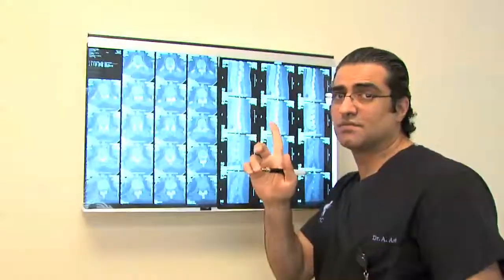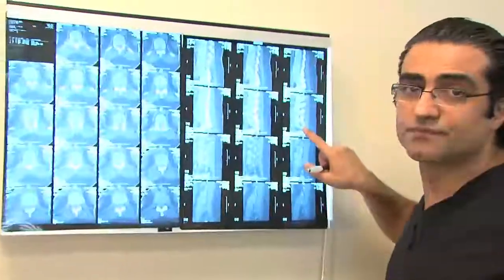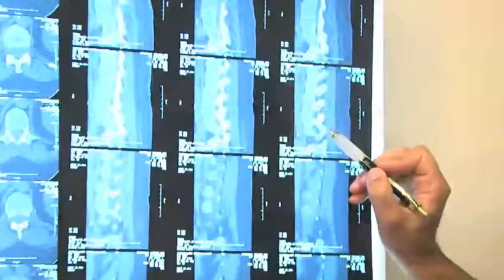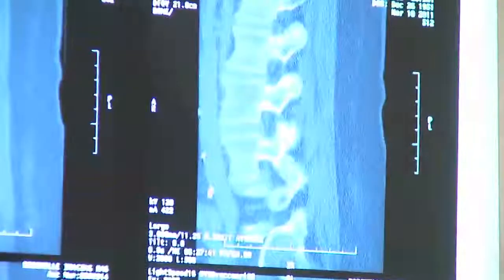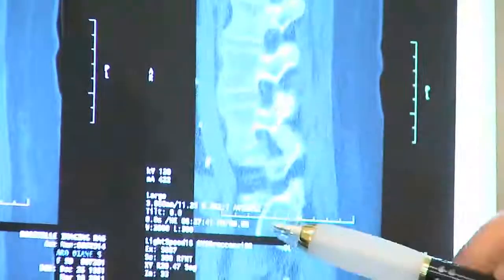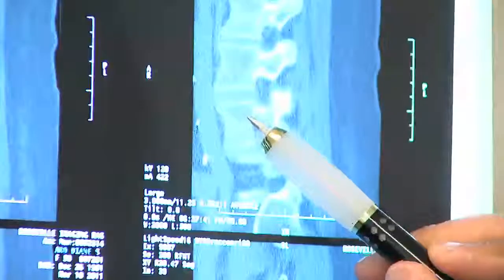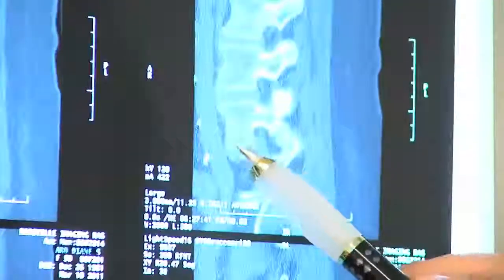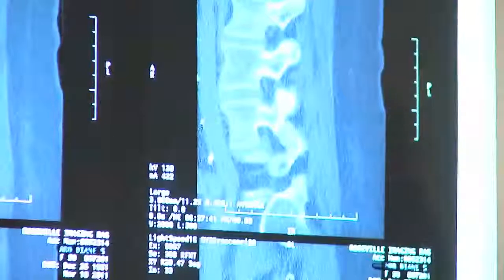However, in this patient, if you focus on this image right here, you can see that in this section there is a fracture — a PARS defect. Normally, vertebrae connect above and below through the facet joints in the back and discs up front. If there's a fracture, the connection between vertebrae is only through the disc, which can go bad under too much pressure and cause slippage.